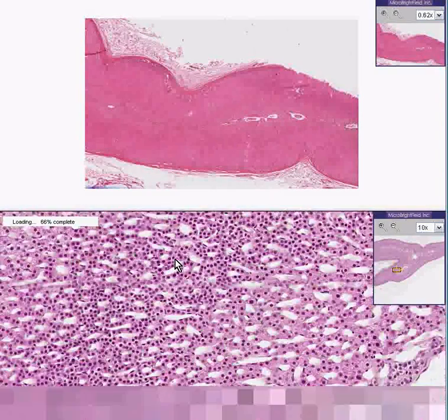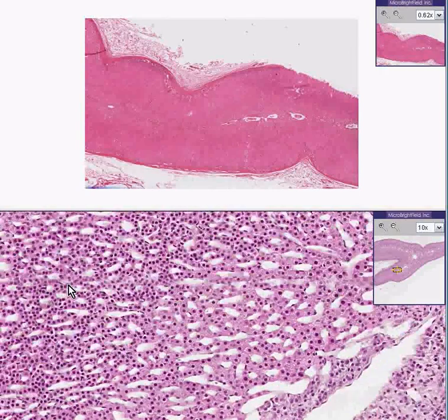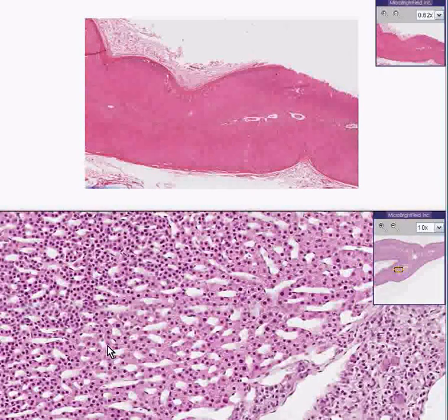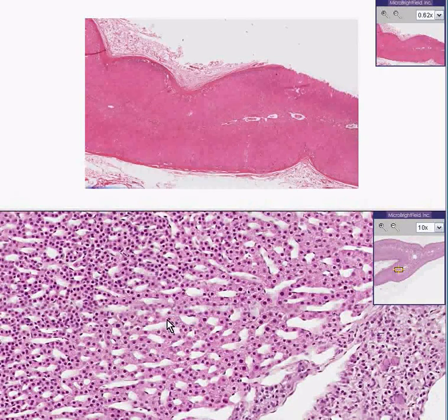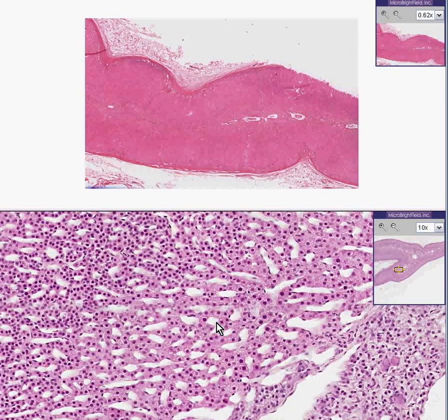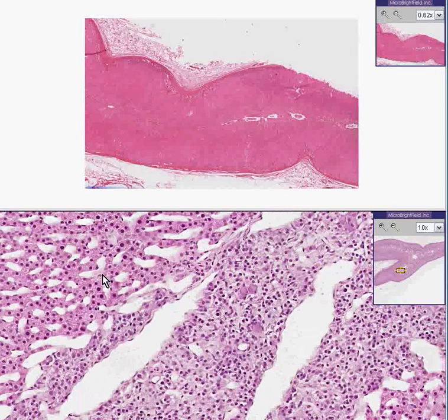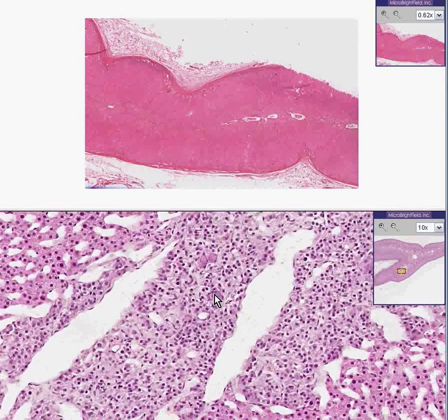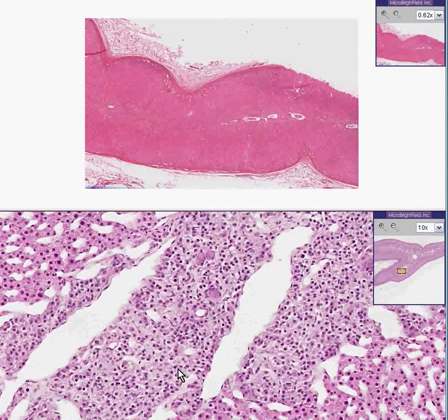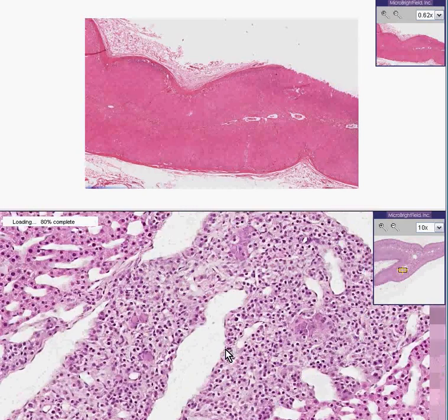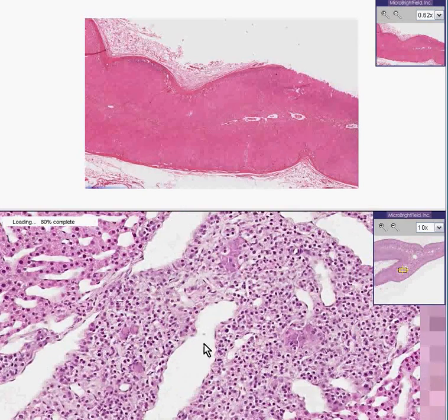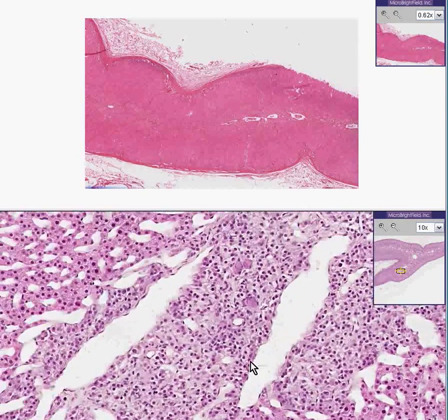Once again, deep inside, you have more of a reticular pattern — so that's the zona reticularis. Here you have some material in which you recognize things like ganglion cells and a lot of very big blood vessels, so this is the medulla.